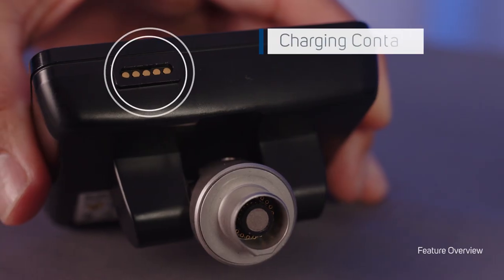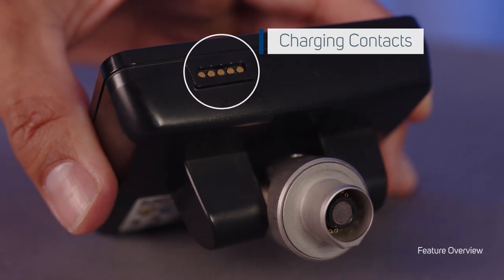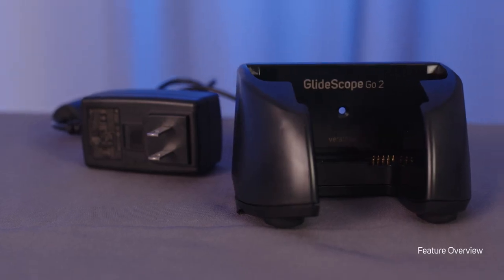Along the bottom of the device, there are charging contacts that can be used with the GlideScope Go 2 charging cradle. The charging cradle is sold separately.